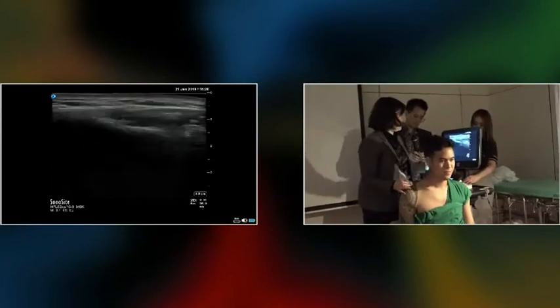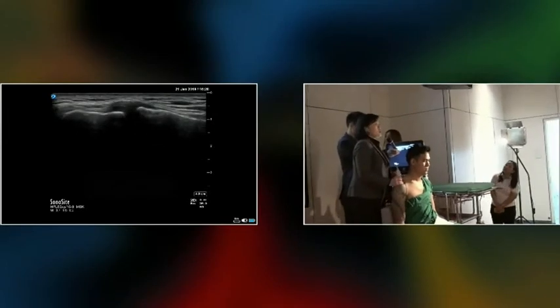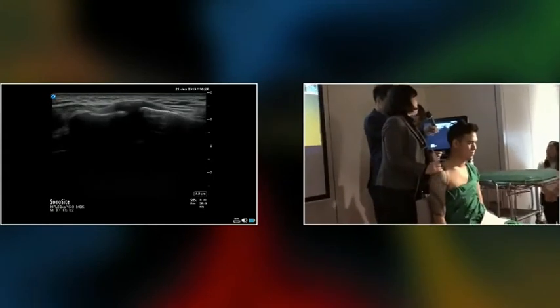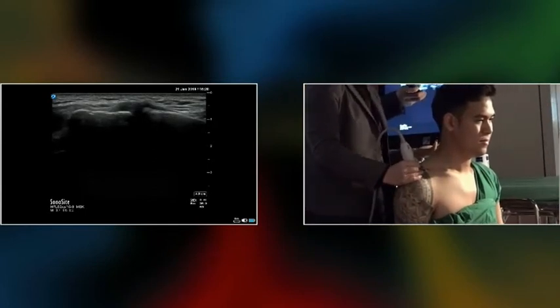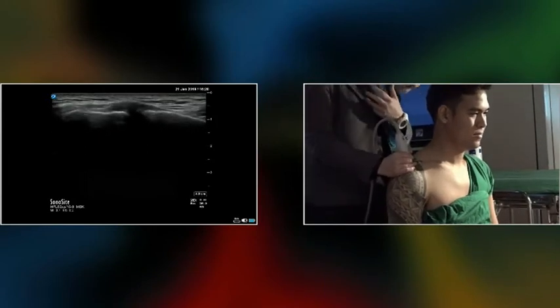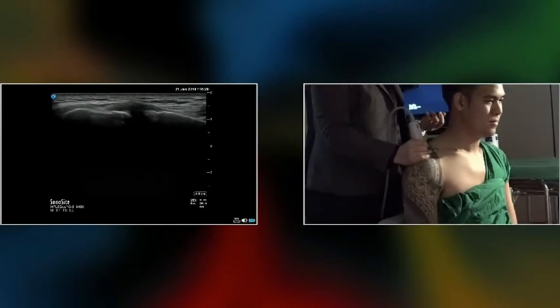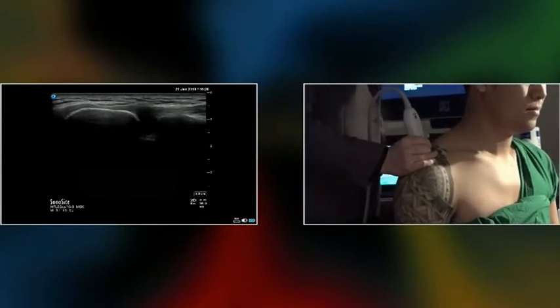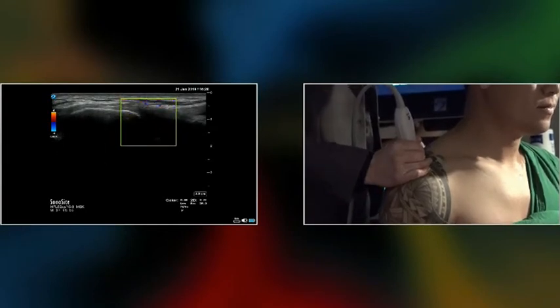The easiest thing is to see the joint. Okay, so you can see in the middle, this is the acromioclavicular joint, AC joint. Normally, unless people have trauma, they seldom have real effusions or dislocation here. But with bikers, a lot of the time, collisions and road traffic accidents, if they have pain there, then you can scan on it and see if there's avulsion or displacement, and sometimes with pain you also would like to see the color Doppler signal, anything around that.